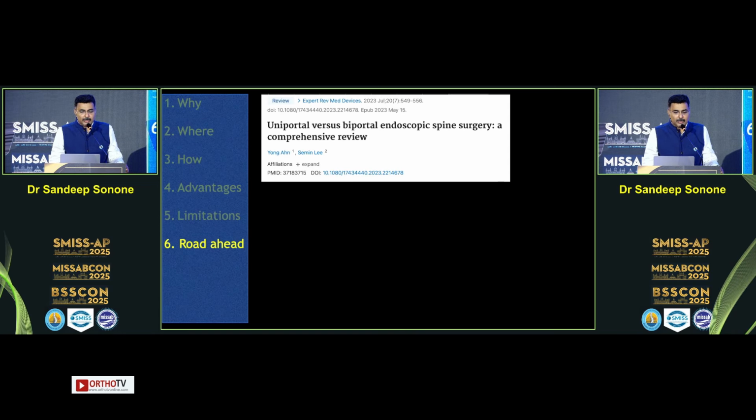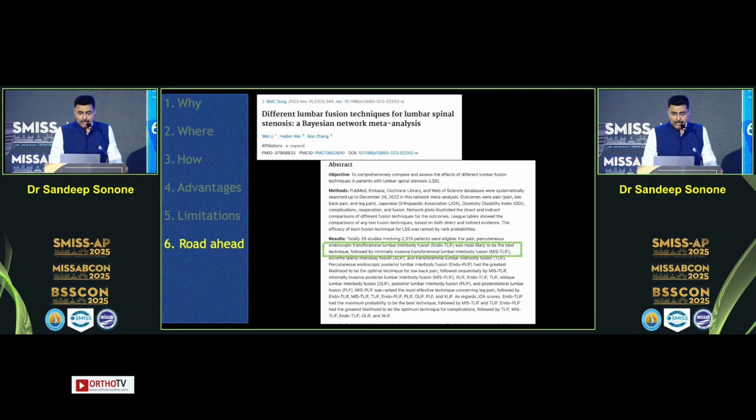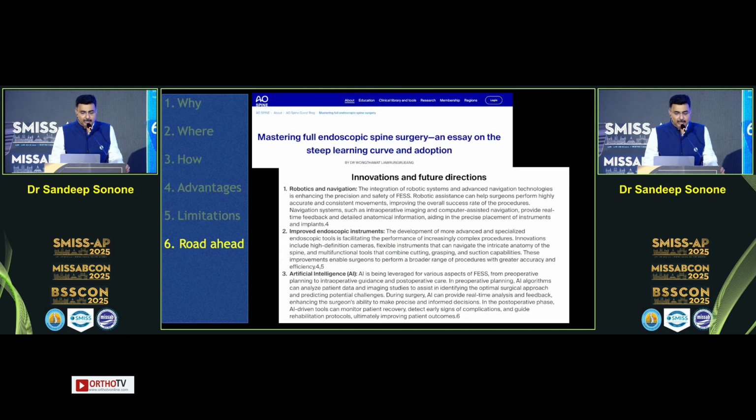So what is the road ahead? Most of the literature now is not a debate about endoscopic versus MIS. It is between endoscopic approaches, uniportal versus biportal. And there are studies which show that as we go along, a lot of fusion surgeries are going to happen minimally invasively. So it's better to adapt as early as possible. And there are newer techniques which will come in, like robotics and AI, which will definitely aid us in carrying out these endoscopic procedures.